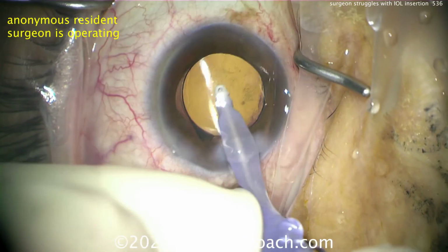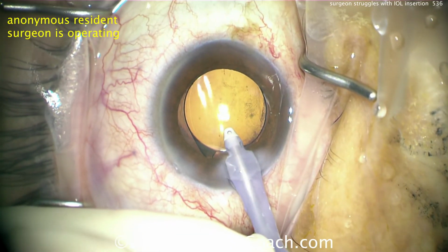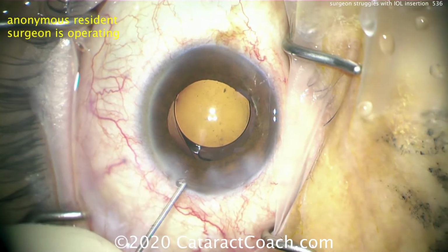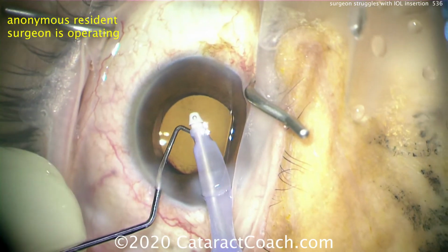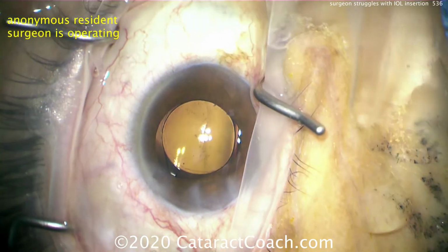Are we done? Well, the title of the video is the resident's going to struggle, so you know we're not done. We're going to be struggling. In fact, from the time of putting the IOL in the eye, it took the resident an extra 15 minutes just to finish the case. Here's why. What's the lens position now? It's decentered. The lens is just not staying centered.